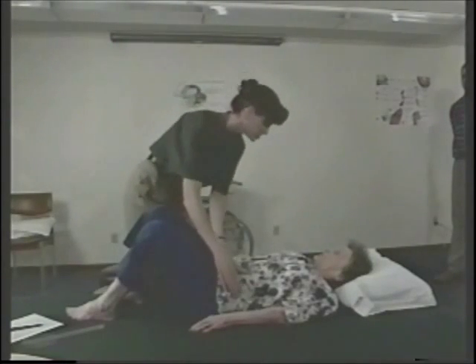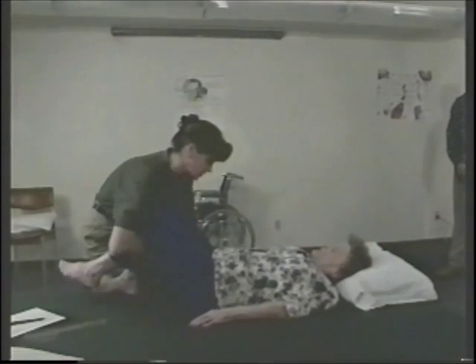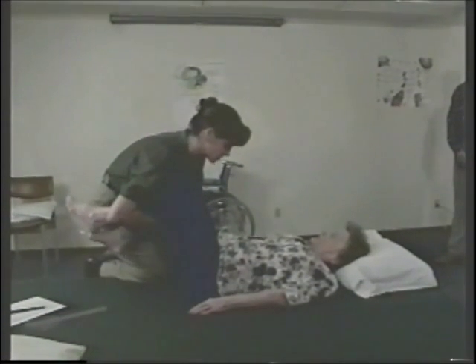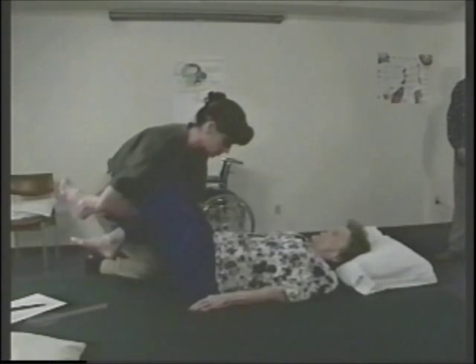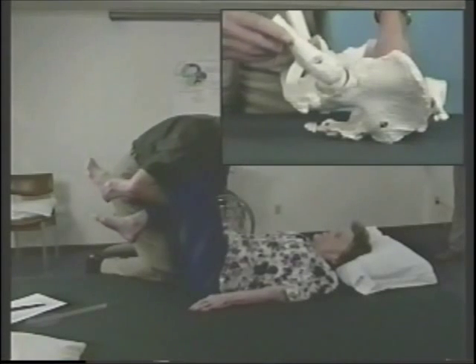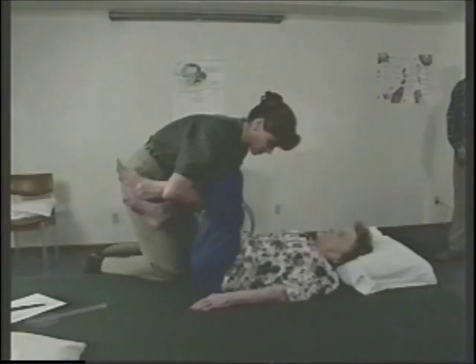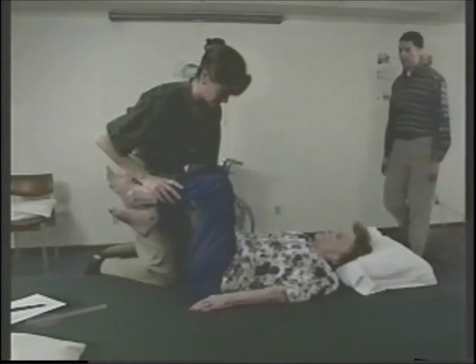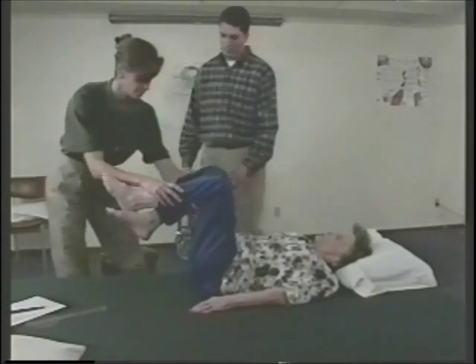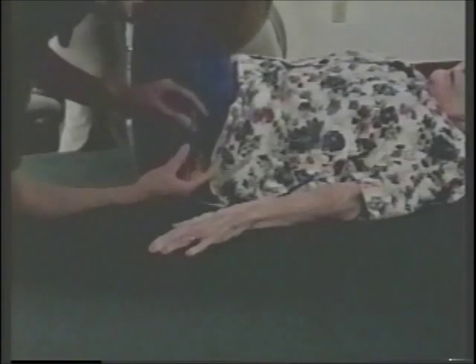I'm going to look at your hip range of motion and do both of them at one time, holding on to your pelvis. Relax your legs down into my arm and I'm going to bring them up — just me, you don't need to help me. And now I'm going to measure this, finding the bony landmarks with a goniometer. Bob, if you could help me hold her legs in this position so we can measure.